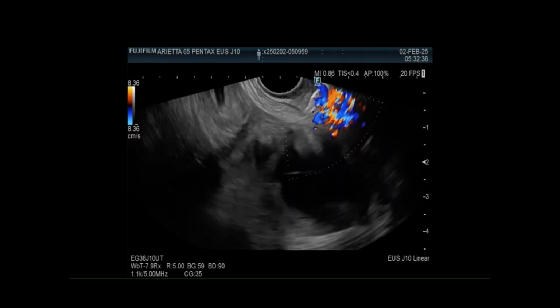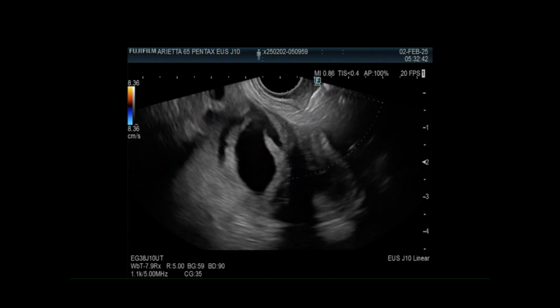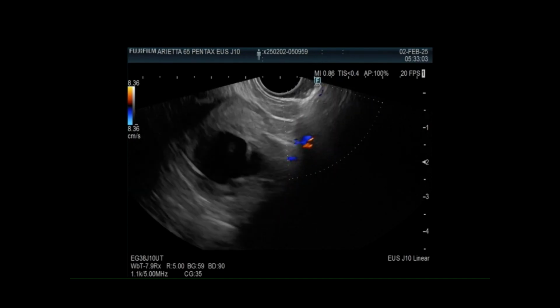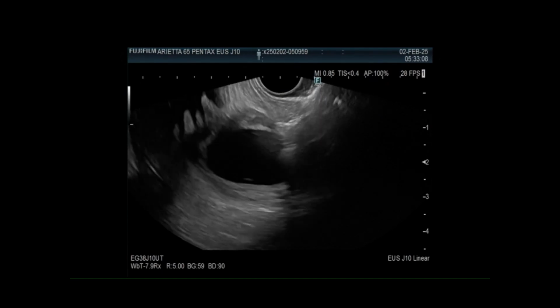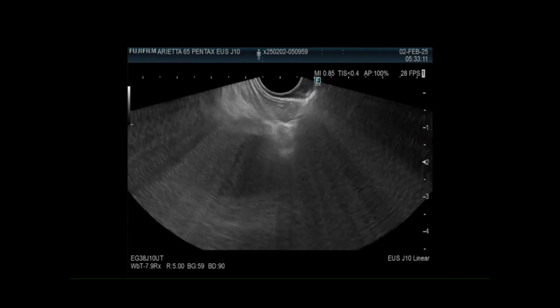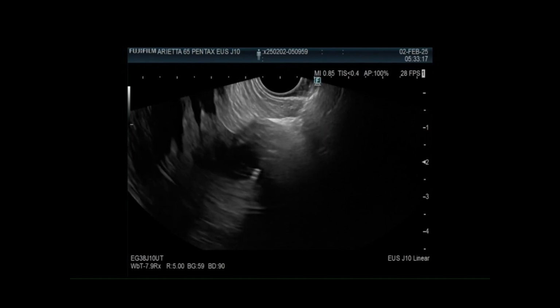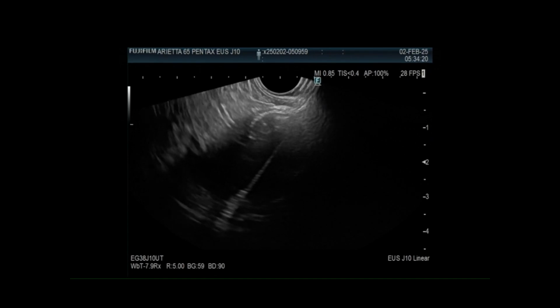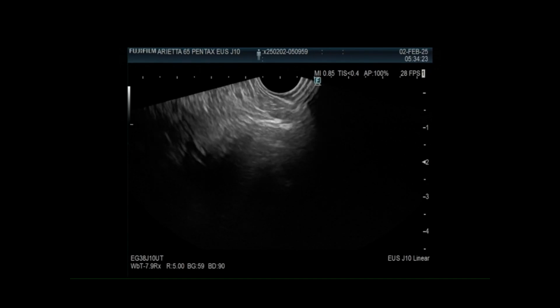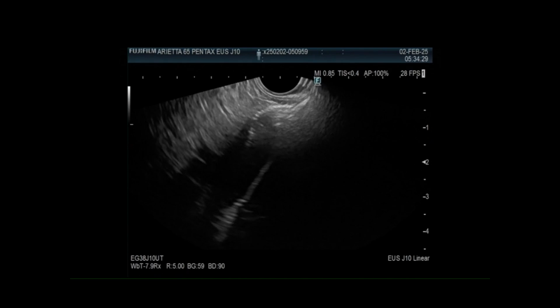After insertion of a catheter, which continuously irrigates a huge amount of normal saline, we put the hot AXIOS and try to pierce the gastric wall and duodenal wall with the stent itself. Then we open the distal flange of the stent and pull the stent towards the gastric wall to ensure that the 1 cm length stent is completely apposed to the gastric wall.